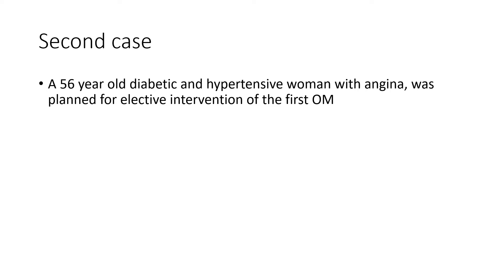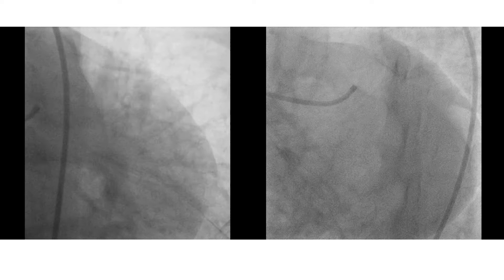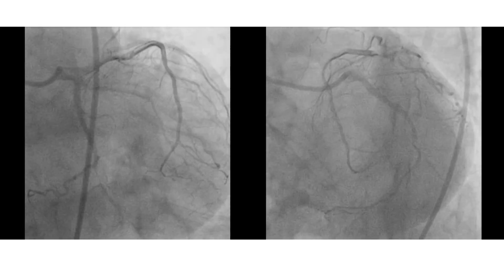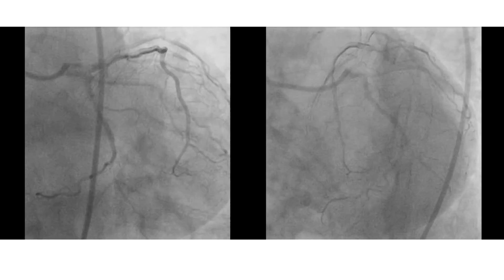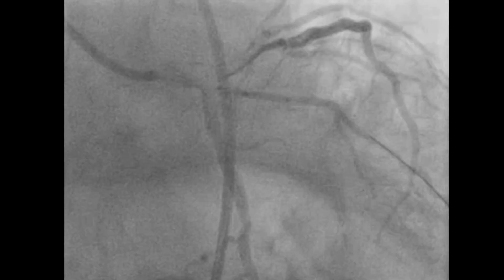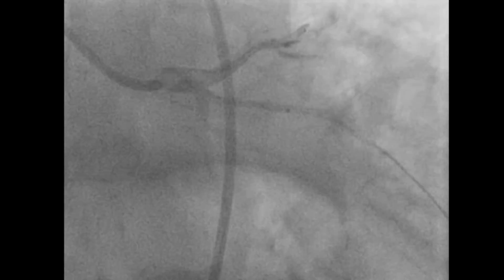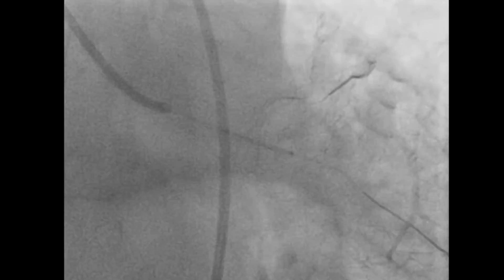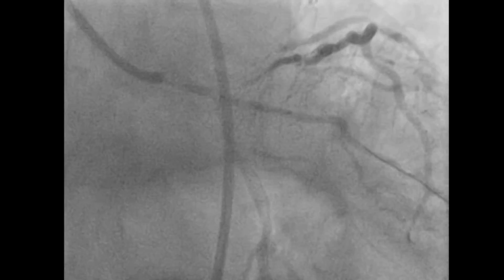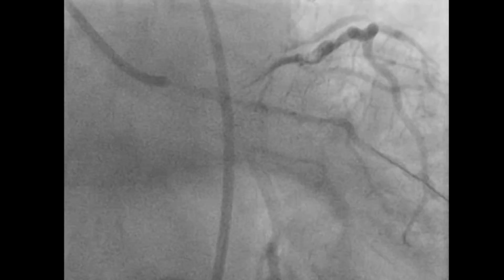The second case was a 56-year-old diabetic and hypertensive woman with angina, planned for elective intervention of the first OM. The angiogram shows stenosis near the ostium of the high OM. The OM was wired, then predilated, and the stent positioned. We can see the same thing happening — the stent is moving, and in this case is moving up to the ostium of the left circumflex.